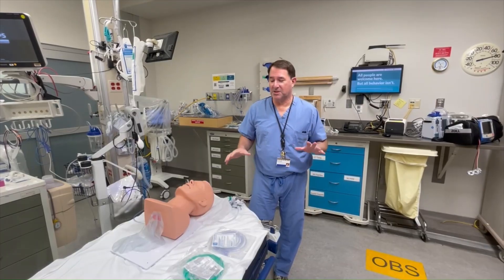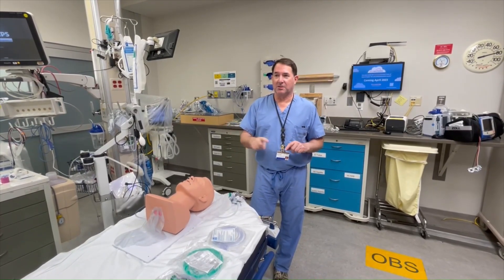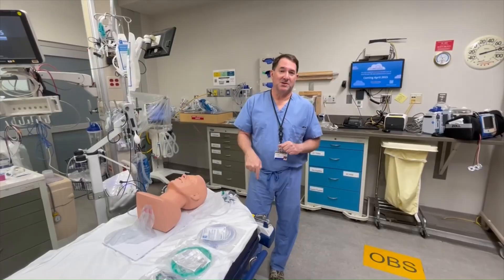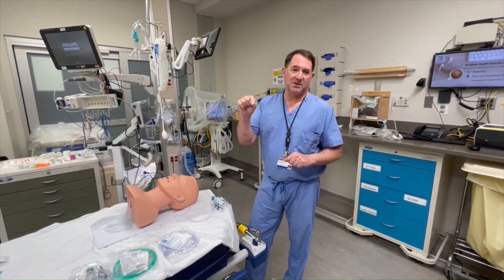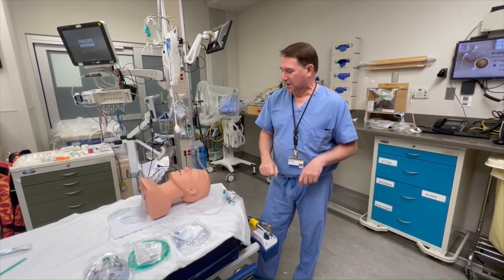Hey, Kevin with emergency medicine. I'm here to talk about apneic oxygenation, no-DSAT, or pre-oxygenation prior to intubation — whatever you want to call it. This is for the adult emergency department. This is our protocol, our habit, this is how we do things.